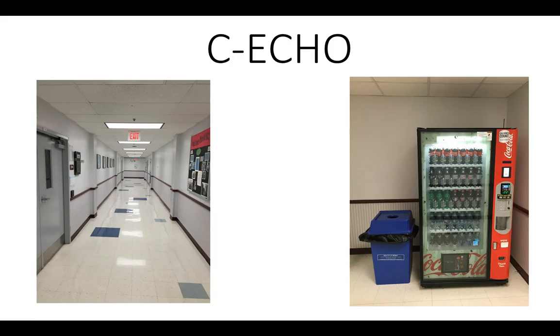I better go check. So I walked down the hall and around the corner and confirmed the Coke machine is still there in its little cubby hole where I thought it would be. So in DICOM terms, I just did a C-echo of the hallway Coke machine.